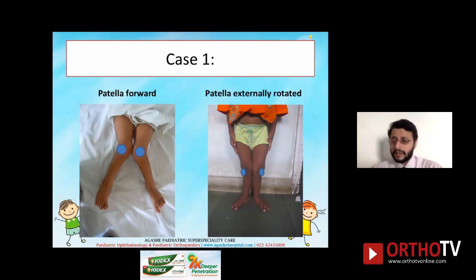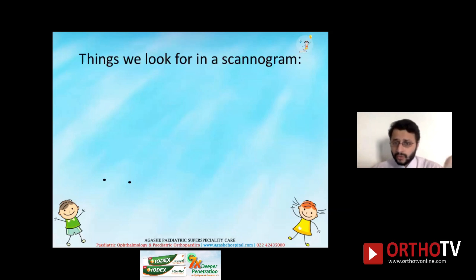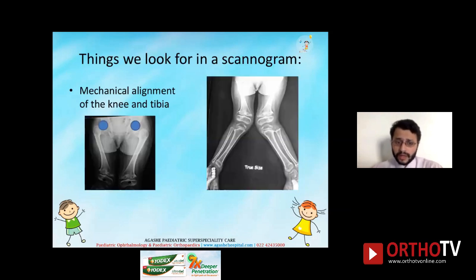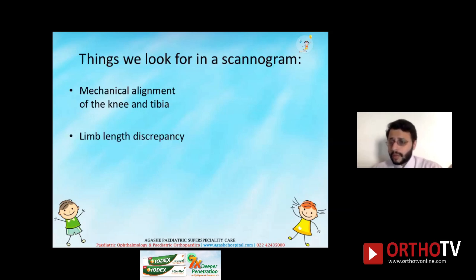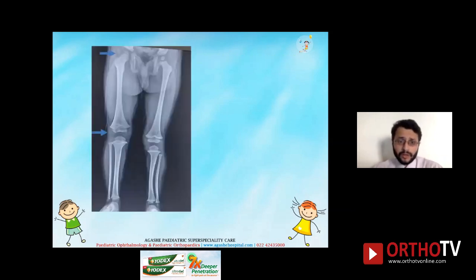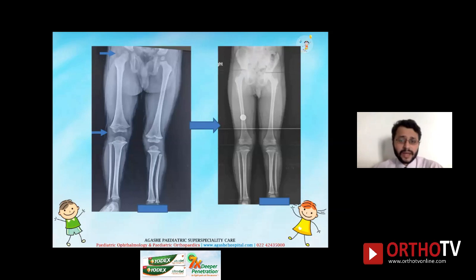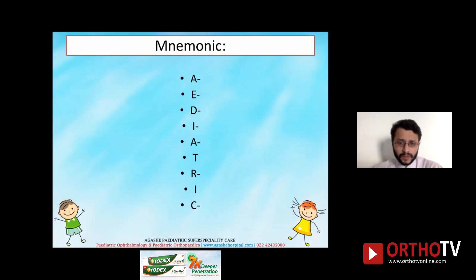When the limbs are externally rotated, the deformity is completely gone and you get an X-ray which looks almost normal. For a proper scanogram, you need the mechanical alignment of the knee and tibia — the center of the hip and center of the knee in a straight line — and you should know the mechanical distal lateral femoral angle, proximal tibial angle, and limb length discrepancy. To measure limb length discrepancy, place a small block under the shorter side so both iliac wings are in the same line, squaring the pelvis. The first teaching point is: proper positioning is exceedingly important when looking at angular deformities, especially around the knee.